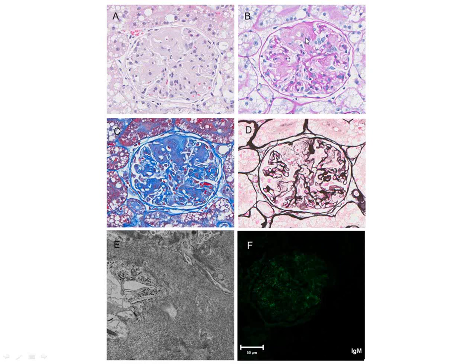I maybe see a few hypertrophied podocytes at about 1 o'clock. And then on the trichrome, it's trichrome positive as well. In that area it's a little bit more pale, so I don't know if that's more indicative of protein or edema. I don't know, you don't really get edema there in the glomerulus, so I take that back. And then it doesn't take up the silver.